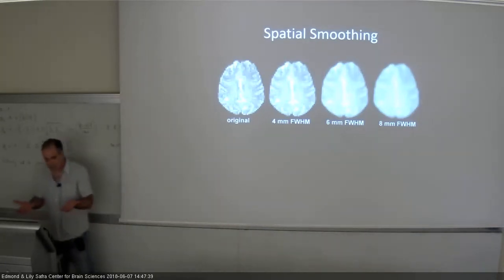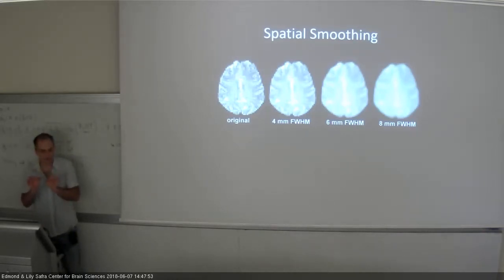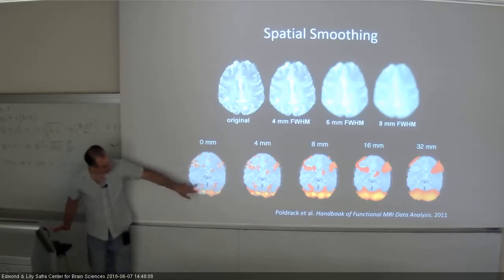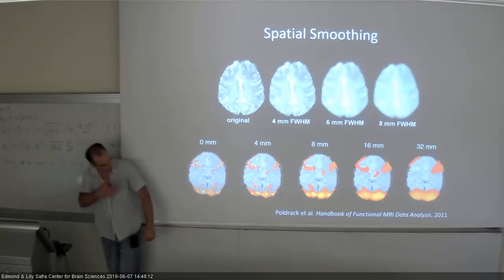It's taking one voxel that wasn't active and another one that was active, and then you combine them, and what you're left with is some average activation that is not really significant, okay? That's one example. And you can actually lose some clusters. If you have very small clusters, let's say 2 voxels that are important but are surrounded by less active voxels, averaging all this out, you get something very non-significant. You lose basically that cluster. So this is just how this kind of data looks, okay? So you smooth again and again.